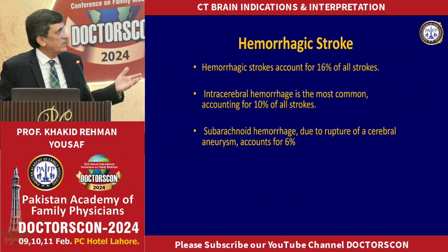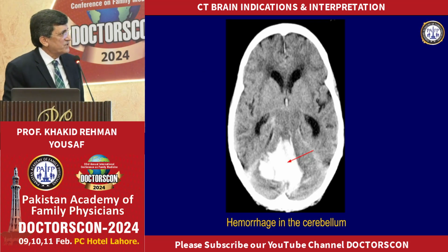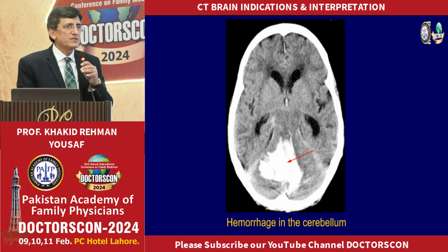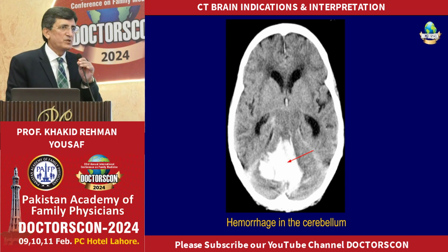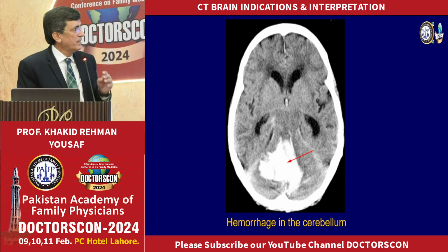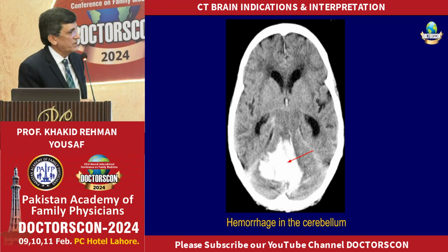Hemorrhagic stroke, I talked about 16% of cases there is a hemorrhagic stroke. This is one example in the cerebellum, and as I told you, hemorrhage appears bright, hyperdense because of the proteins of the heme component of blood. They are much brighter as compared to ischemic stroke.